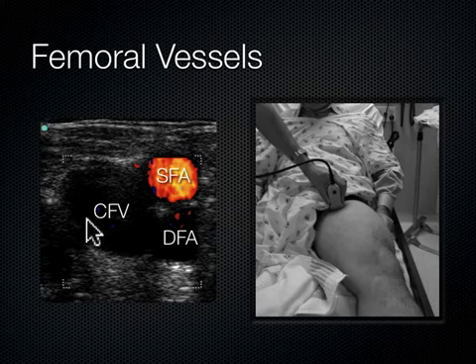Left leg. Very good. How do you know that? Well, he knows that venous, vein, rhymes with venous, penis. And so that's why this is more medial, okay? Or you could say venous vagina if you want to, but the vein is more medial, the arteries are more lateral. That's how I remember it. There was another way to remember it, but I couldn't remember that way.